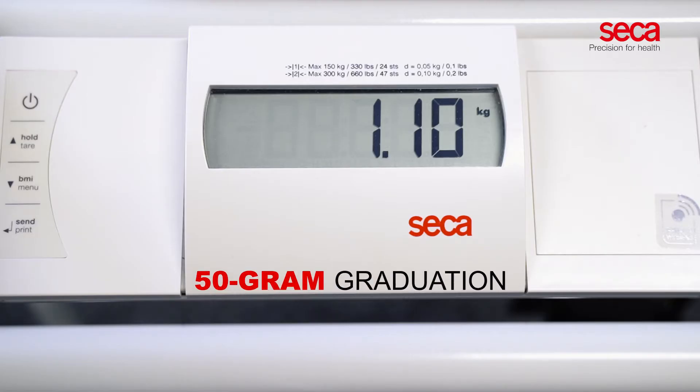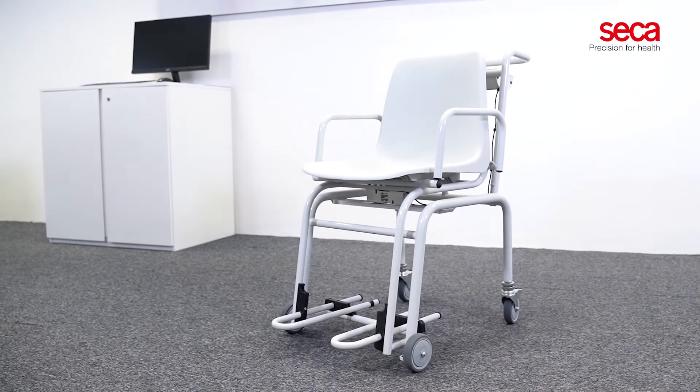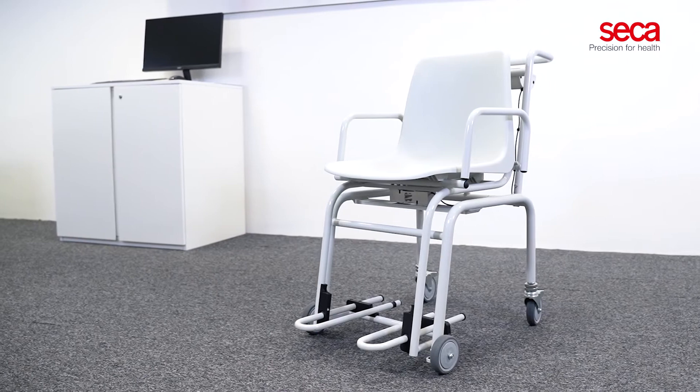With its 50-gram graduation, even the slightest changes in body weight can be monitored accurately. The solid construction of the Sika 954 also accommodates the weighing of severely overweight patients.